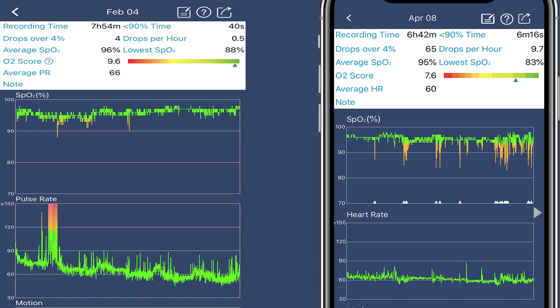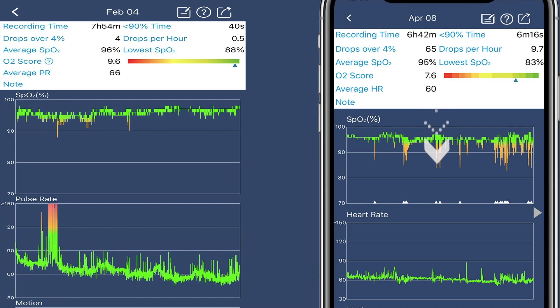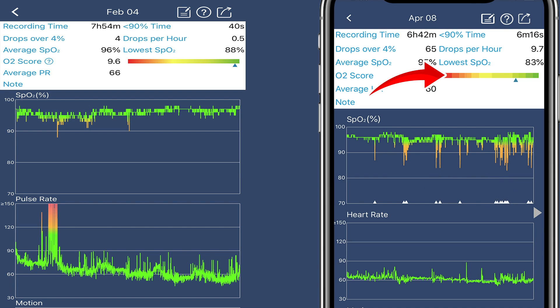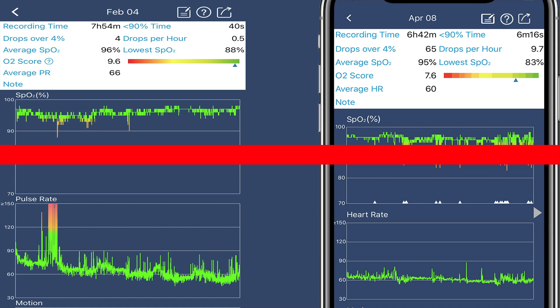Now, if I had to make a guess here, I'd be saying this person in particular would be in the mild to moderate category. You can see here from this little graph up the top that they're drifting down into that yellow zone. But if you're someone who's having a lot more oxygen desaturations than this, and maybe those oxygen desaturations are going into the red zone, then you're more than likely going to have moderate or severe sleep apnea. And this is basically how we do the screen. And it's really simple, really basic, and you can do it as many times as you like.